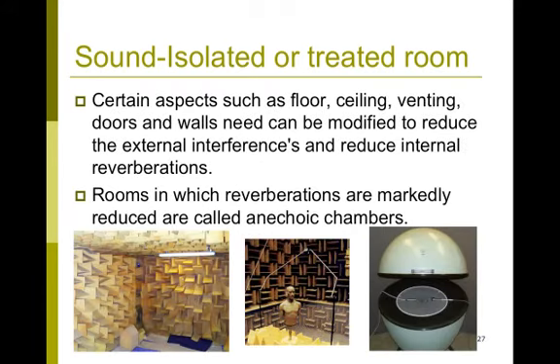How we do that is by adapting certain aspects of the room, including carpeting the floor, and having noise-reverberation-reducing tiles perhaps in the ceiling and in the walls. Your goal is to reduce external interferences and also reduce internal reverberations, like from footsteps and overall building vibrations. Rooms in which these reverberations are markedly reduced are known as anechoic chambers.